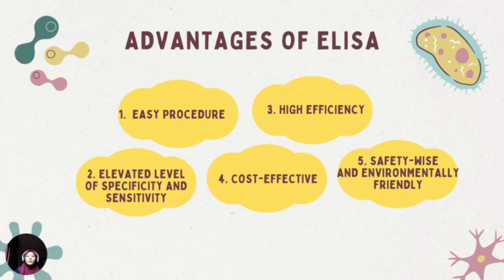And furthermore, safety-wise and environmental friendly. It is not necessary to use large amount of organic solvent or any radioactive substances. The last point will be ELISA is based on antigen-antibody reaction.